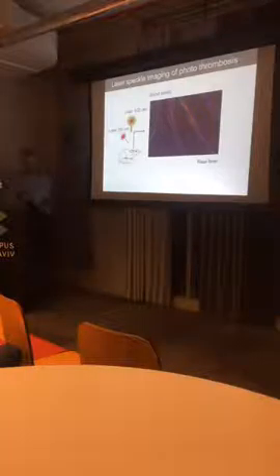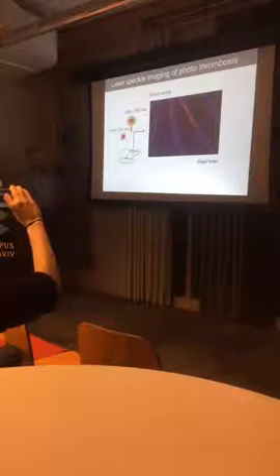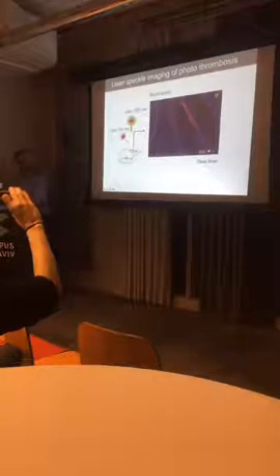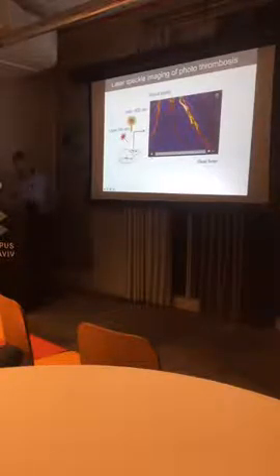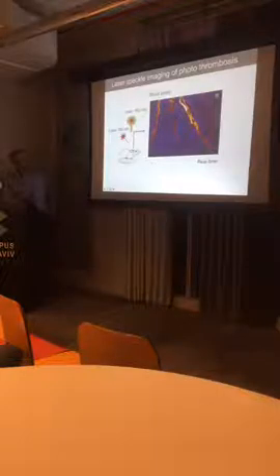What can we get from that? For example, we can observe what happens to the blood vessels if we induce anything in the blood circulation. For example, we can stop the blood flow and see how it's going on. So this is the video. Again, there is a laser for the speckle imaging, and there is a laser to stop the blood inside the blood vessels.